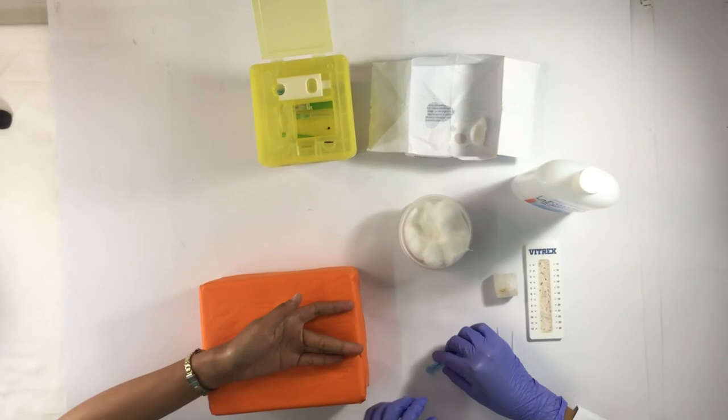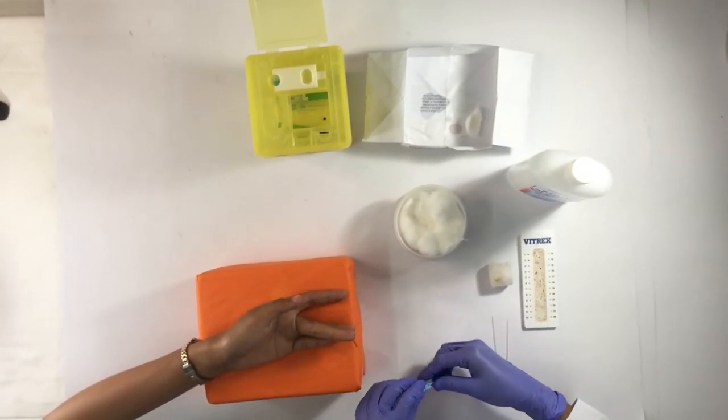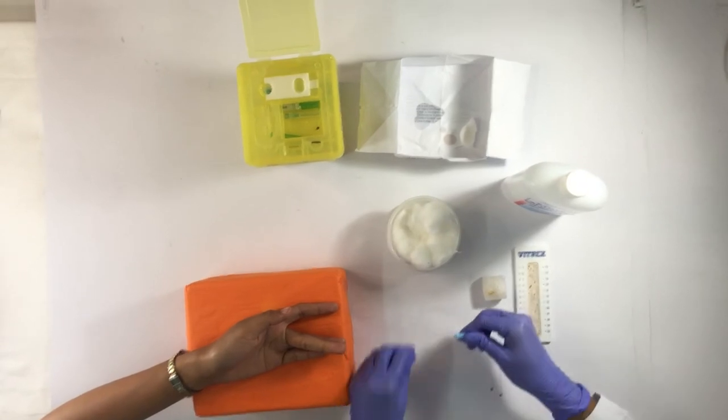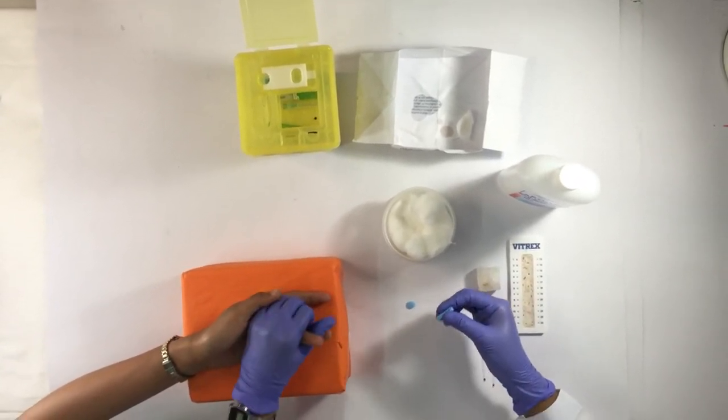While waiting, prepare the materials needed for collection. Remove the cover of the disposable lancet by twisting. This will expose the needle of the lancet.